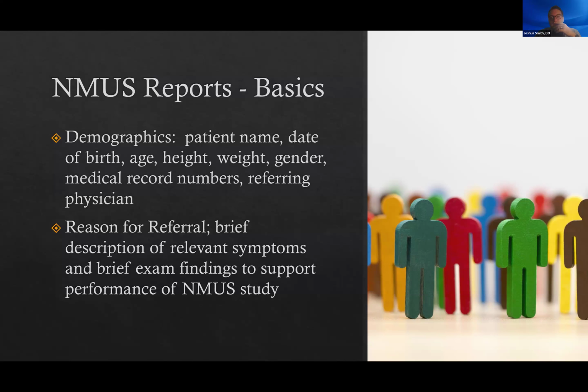Some people might say, well, people come in and they have an order for an EMG and a nerve conduction study and not an order for an ultrasound. So if I do EMG and nerve conduction study and then I add ultrasound, am I able to bill for that? It does depend a little bit on the state where you work. I really haven't had trouble with that in the state of Pennsylvania where I work. Honestly, the cost and how much is billed for the ultrasound is very minuscule compared to the EMG nerve conduction study.